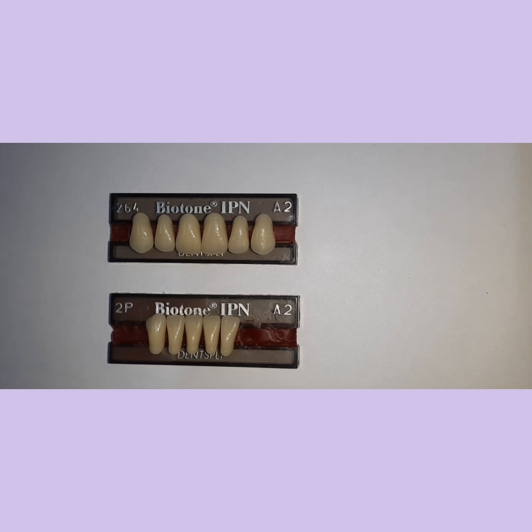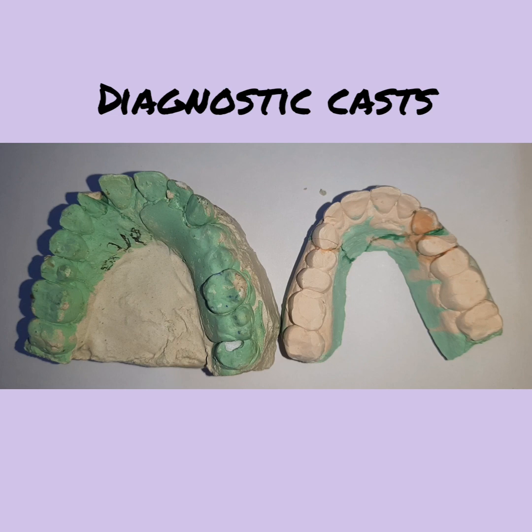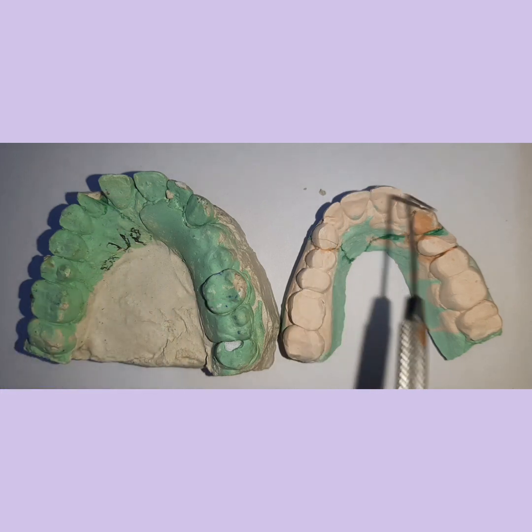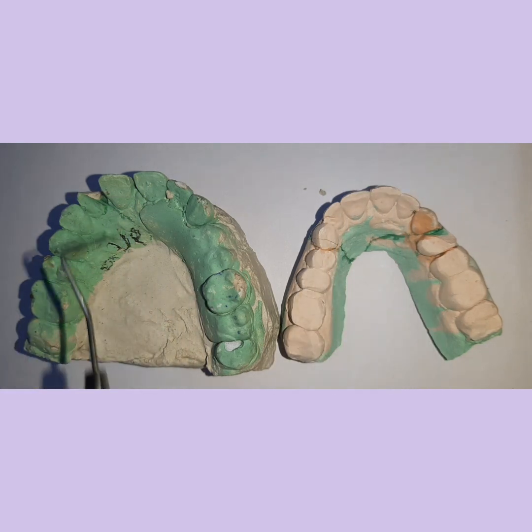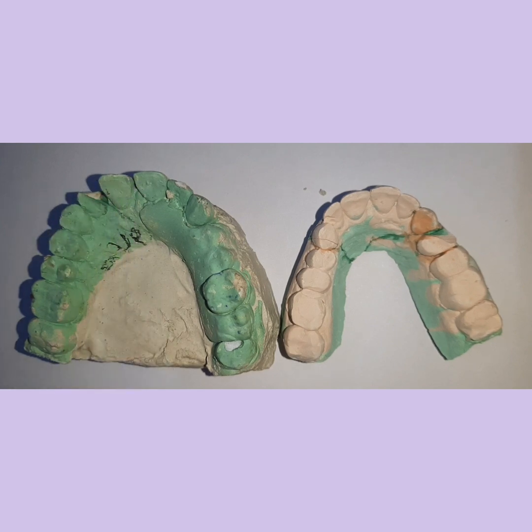Now, what is the importance of diagnostic cast? Suppose the patient has a diagnostic model or diagnostic cast with him, then it is one of the most reliable aids in selecting and arranging the teeth. You can see the arrangement of the teeth. So if we have an edentulous patient who has got these casts with him, then first thing we can select the size of the teeth, the form of the teeth, the position of the teeth. We can have a fair enough idea where we have to position the teeth in the complete denture. It will be very helpful.